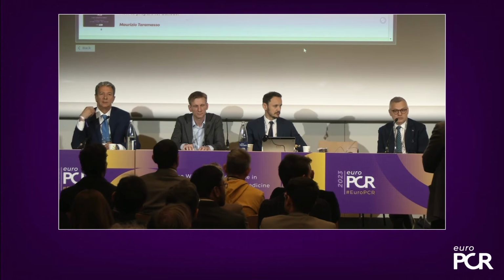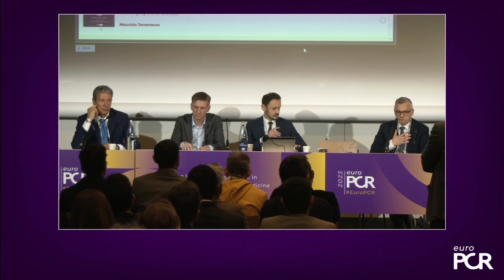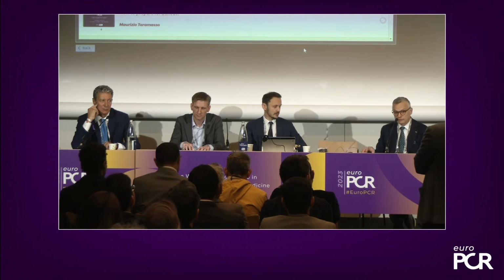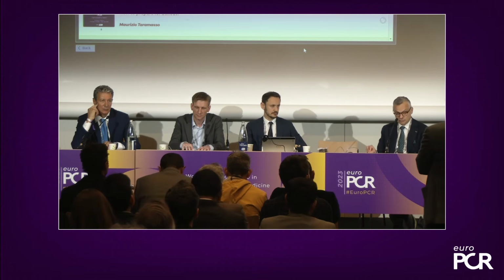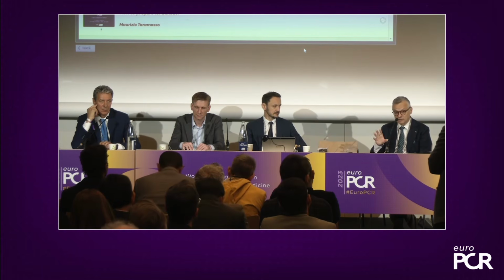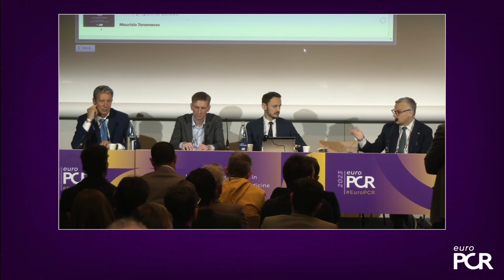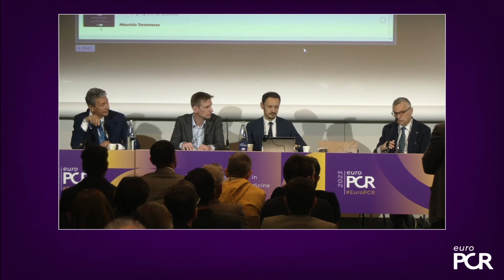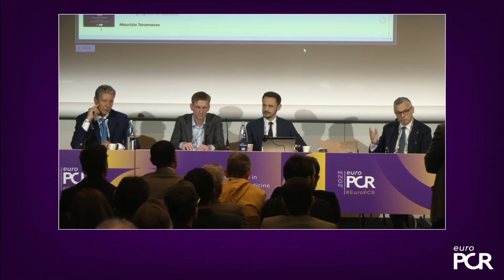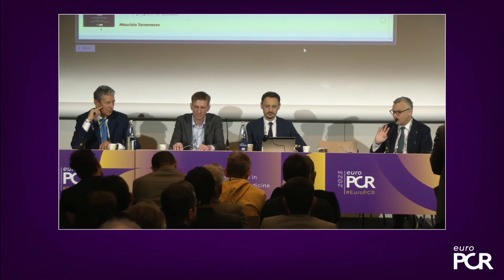So you can obviously always compress. My feeling is that if I exit the procedure and at the end of the angiogram there is no bleeding evidence, I feel much better than being there and compressing. I don't know what you do, guys, but we have been changing a bit. In the past we compressed for half an hour, 2 hours, 3 hours. Now I don't want to see that.